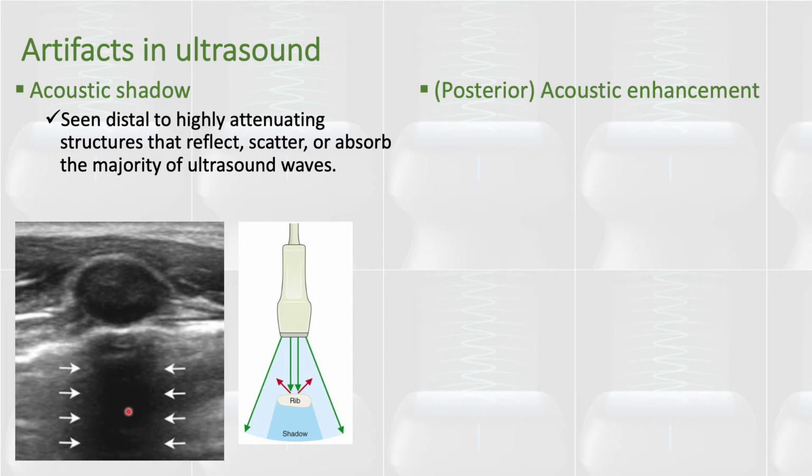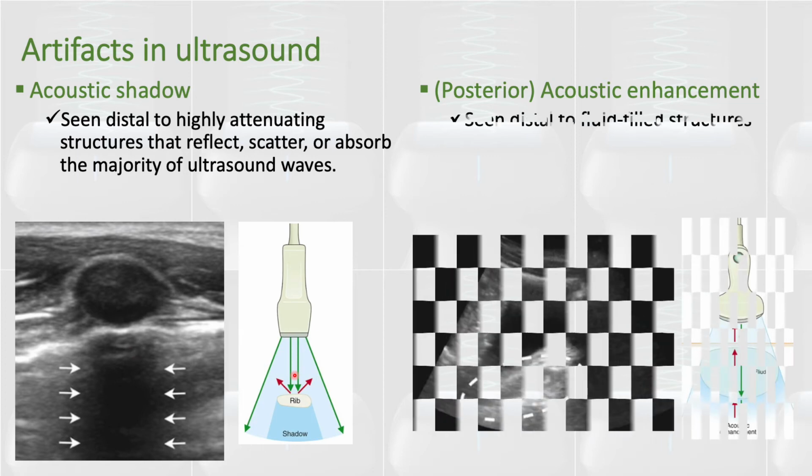This is why when we do lung ultrasound, we try to keep the bone or the ribs at the side so that we have the lung tissue in the middle instead of the acoustic shadow. So keep that in mind. This acoustic shadow can make the examination a little bit difficult if you cannot avoid it. And this is again a schematic representation of that artifact.